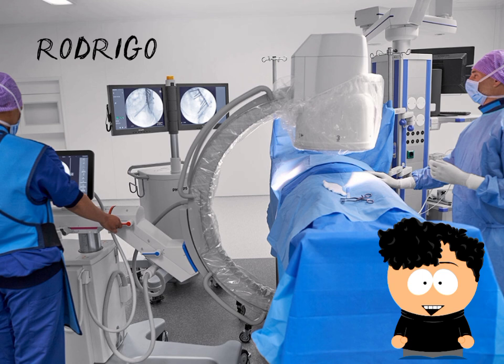Safety and protection. Radiological protection: measures should be taken to minimize exposure to X-rays for both patient and medical personnel. Equipment maintenance: regular maintenance is necessary to ensure the equipment functions correctly and safely.